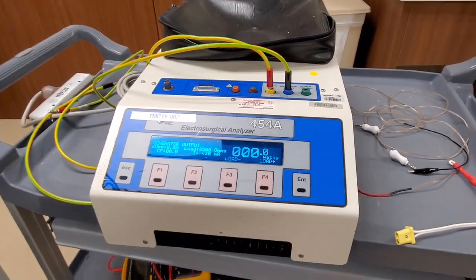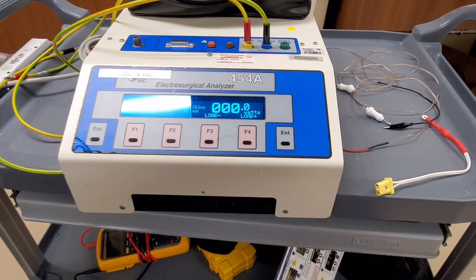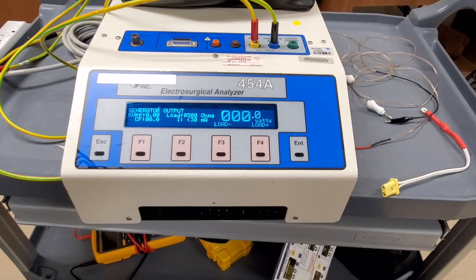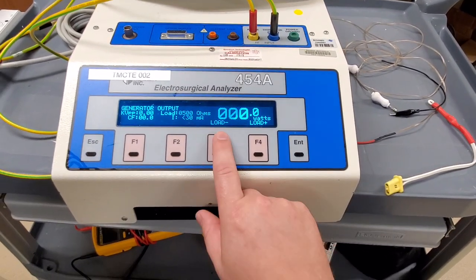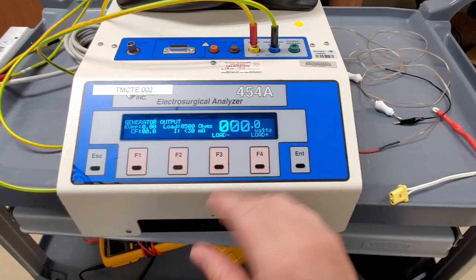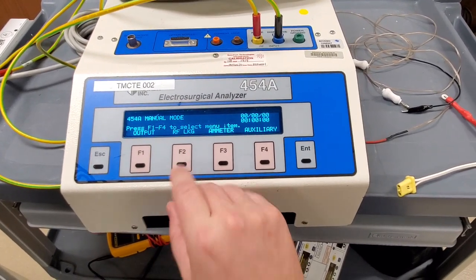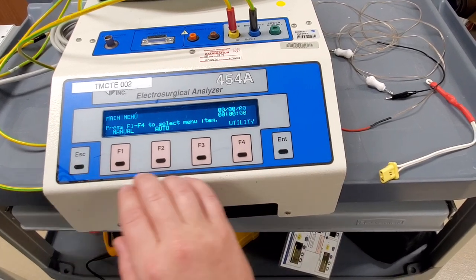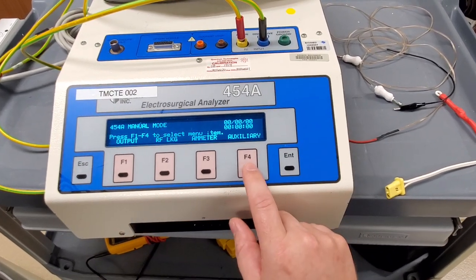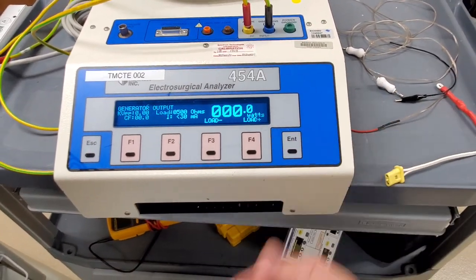So guys, you might recognize this unit right here. This is the tried and true 454A. Look at that large beautiful display - it's flickering a little bit in the camera but it doesn't flicker in real life. Very simple interface. You can see I've got a load plus, load minus, and right here is your output watts. It's actually very simple. This unit has been the standard for a very long time.